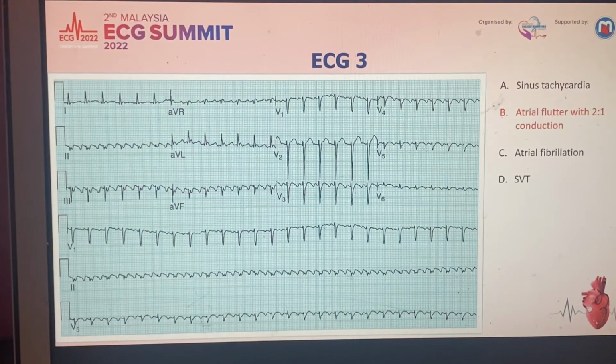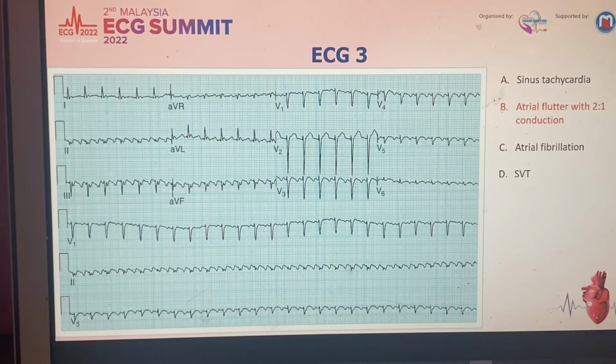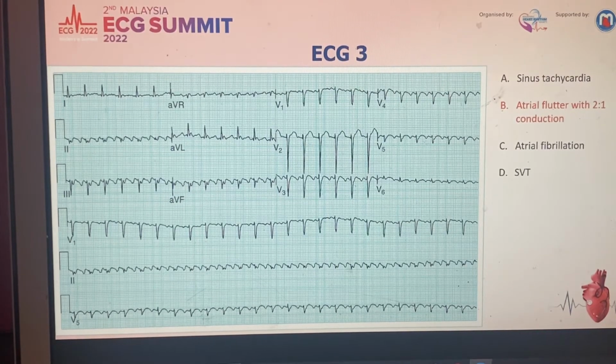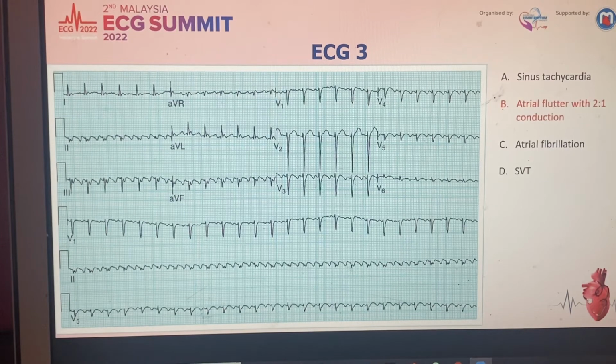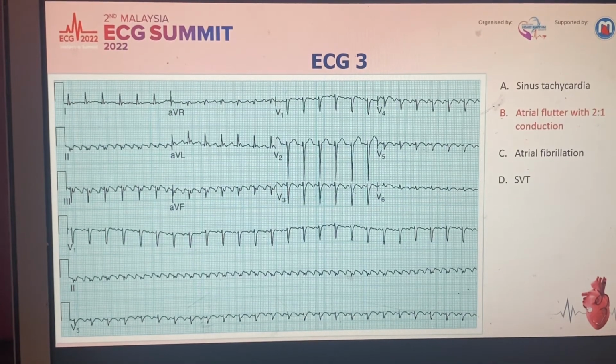But regarding the ECG machines, we have old machines where you print out one lead, then followed by another, compared to the relatively new ECG machine that you can get a 12 lead ECG in one go. If you try to do the Lewis lead using the relatively new ECG machine, you really can't print out, because you must have all the 12 vectors together to print out. But if you try the old machine, one lead followed by another, then you can do the Lewis lead.